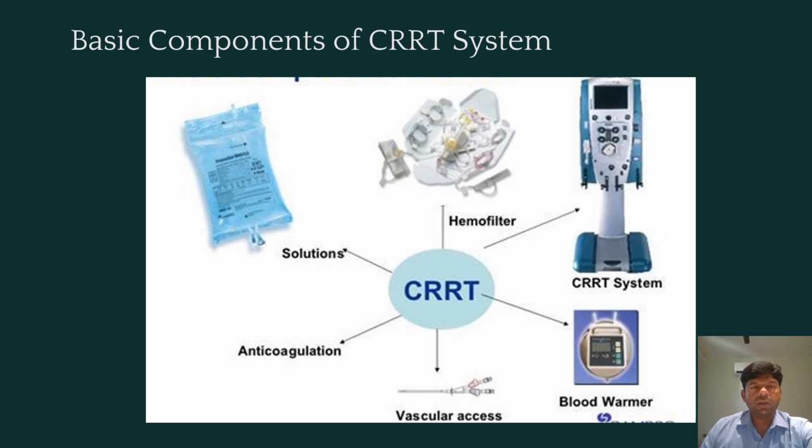Now the next one is how to optimize the CRRT delivery. So these are the basic components of the CRRT system. You all know these: CRRT machine, hemofilter, solution, different types of solution, anticoagulation, vascular access, blood warmer.